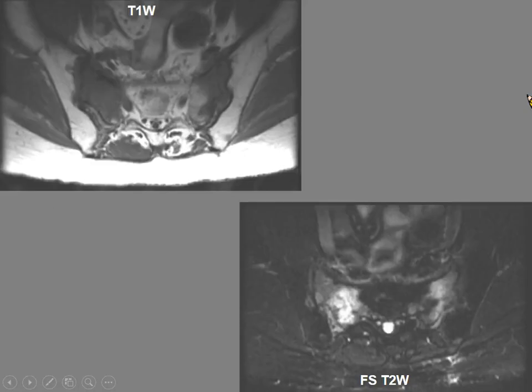I remember this case quite well because it was a case that I saw within my first week of starting work as a young attending at the cancer center. One of the oncologists brought this case down to show me, and it was a patient with CA cervix. In fact, it was one of his relatives, and she presented with bone pain and had an MR performed outside.